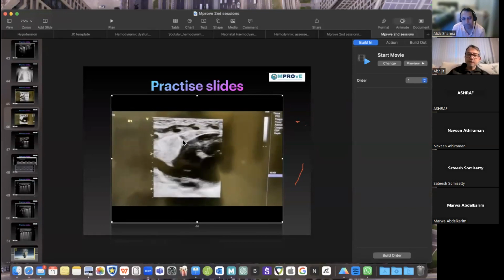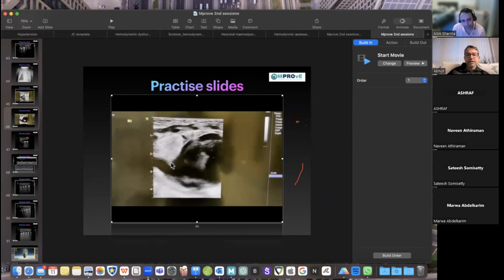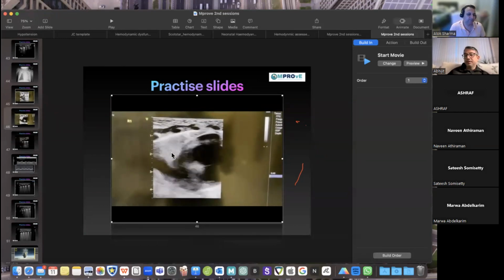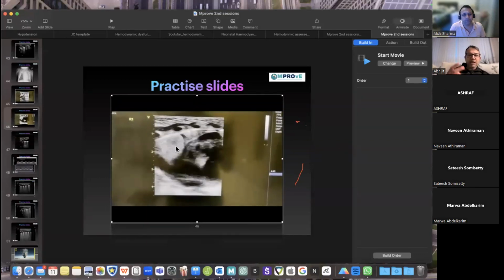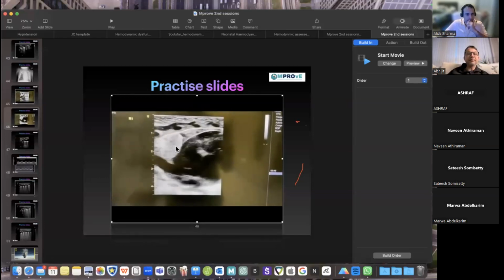Now you can employ your Doppler interrogation on this area, because that's what you have learned. So am I going to see vessels? Yes, absolutely. We're going to see vessels in the thymus. Okay, two for your consolidation and three for the thymus.